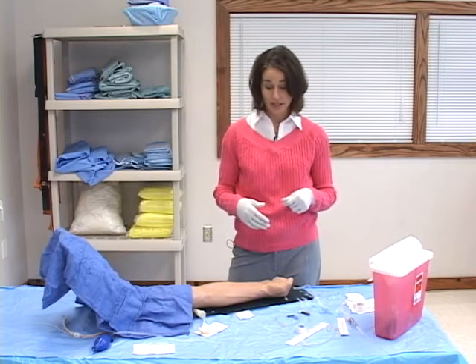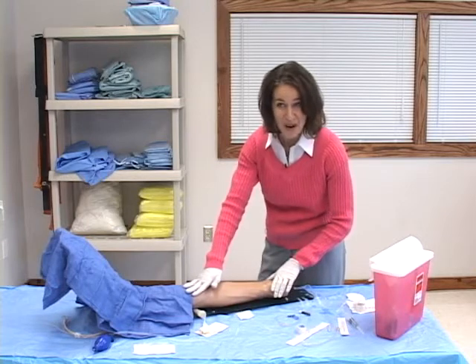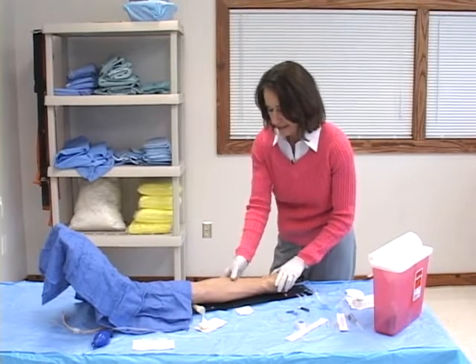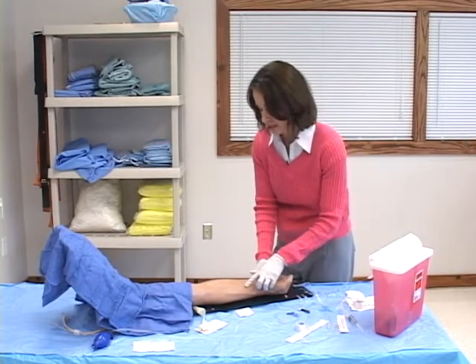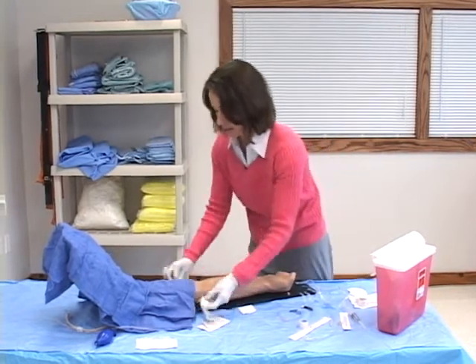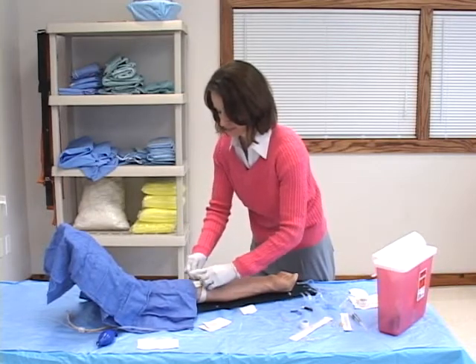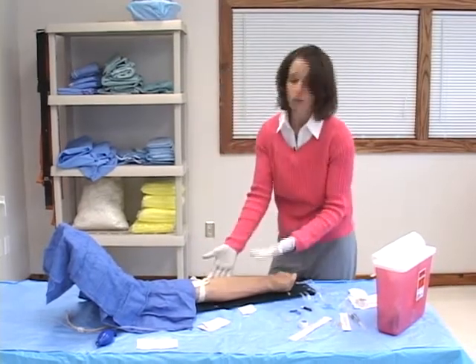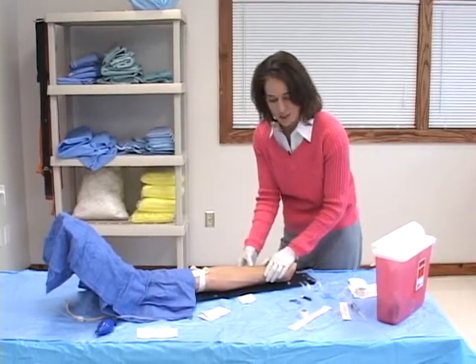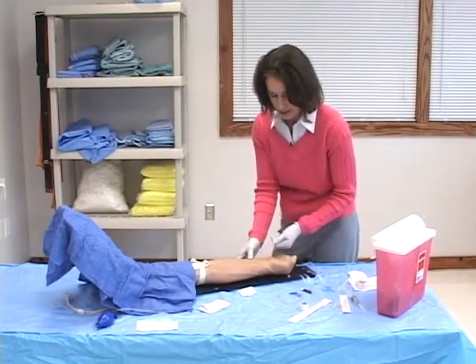So we're going to go ahead and get started. This is a little bit bigger than your typical pediatric arm, but the principles are the same for starting the IV. So you're going to take a look at the patient's extremity, and you see I have some nice veins here that I would like to be able to use. So I'm going to take my tourniquet, put it into place, and that will help the veins become more visible and pop out. And I'm going to palpate a nice, soft, squishy vein and decide upon my site that I want to use.